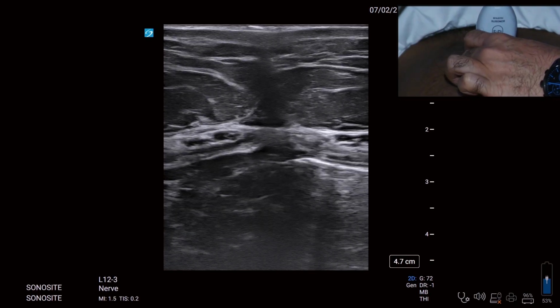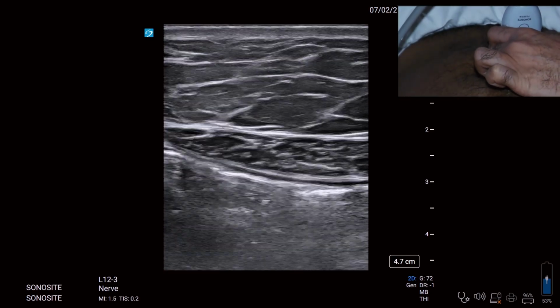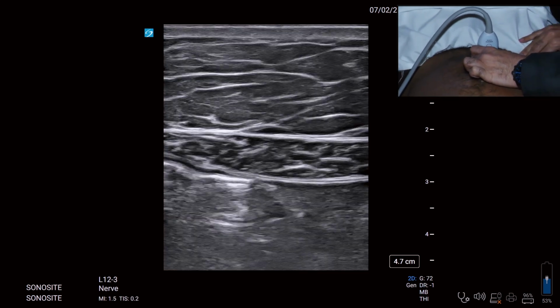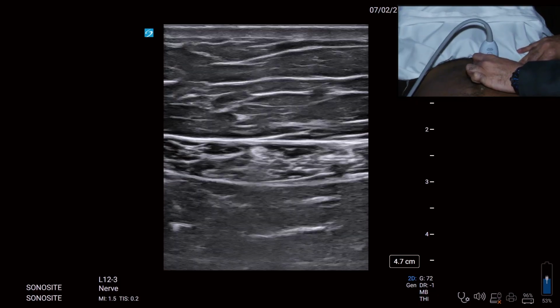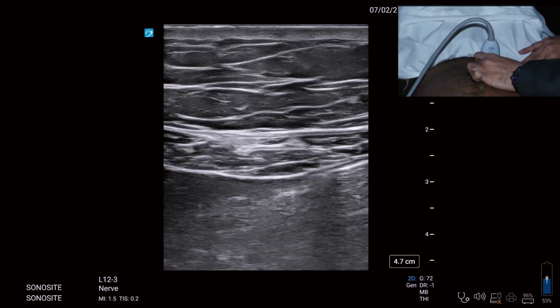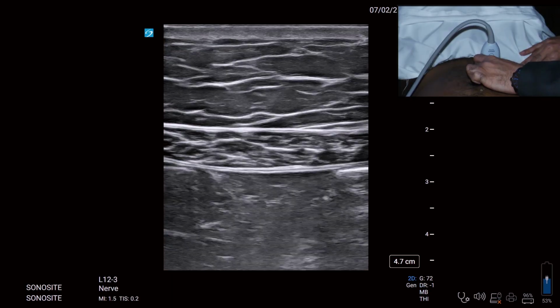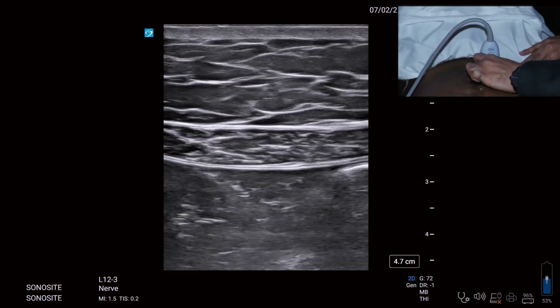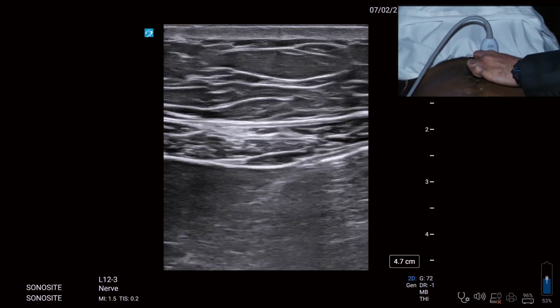So I'm right in the midline, just below the umbilicus. Okay, I'm moving one side to the lateral. Can you see the twin track appearance still there? Okay, I'll keep moving down. A point will come, this double appearance will disappear, and only a single line will be reflected back. Can you see only one line is there? Can you appreciate only one line is left? I go back up 2 lines, I go back down 1 line, I go back up 2 lines, I go back down 1 line. So I have reached the arcuate line level.